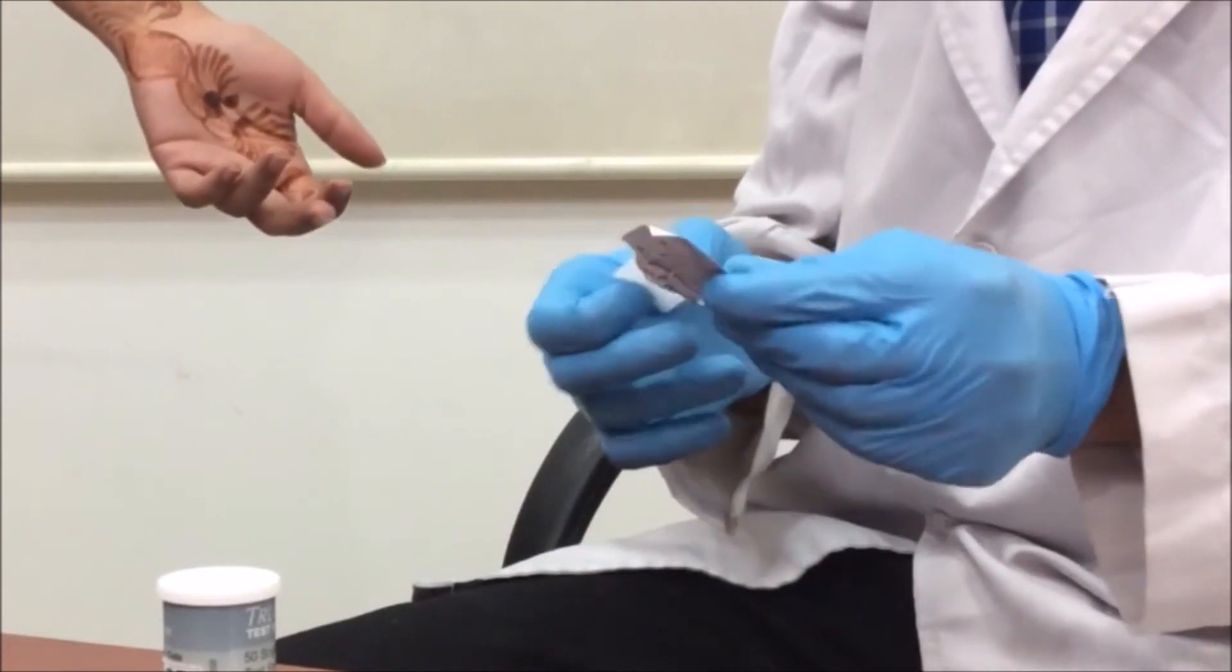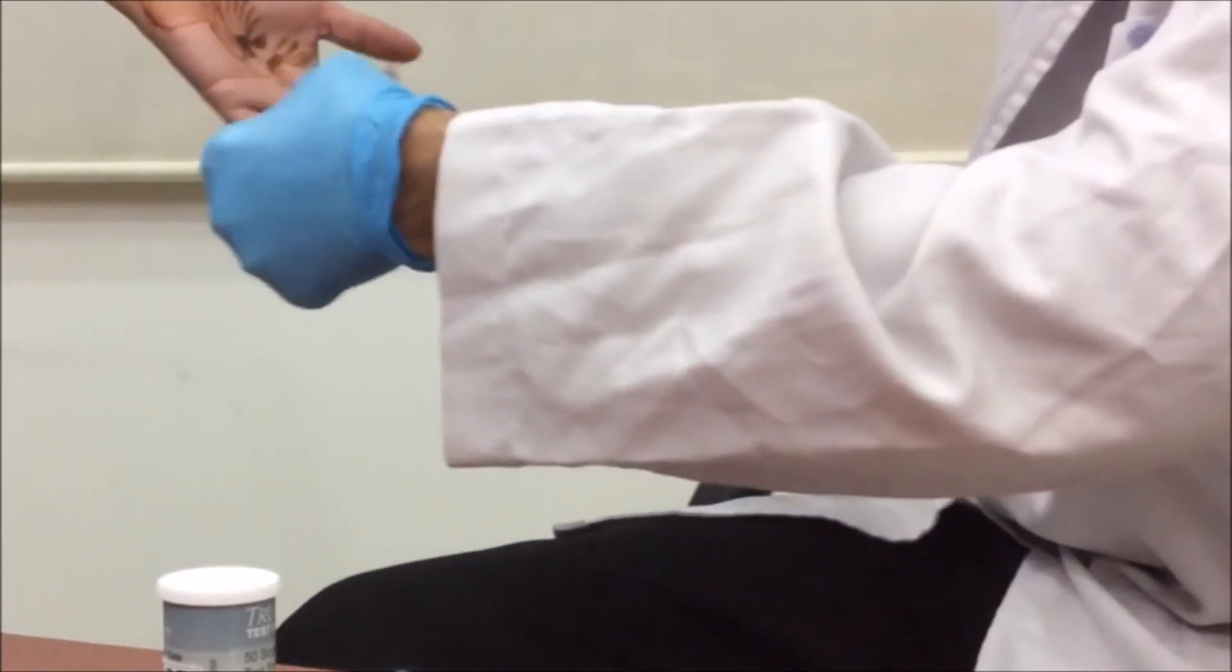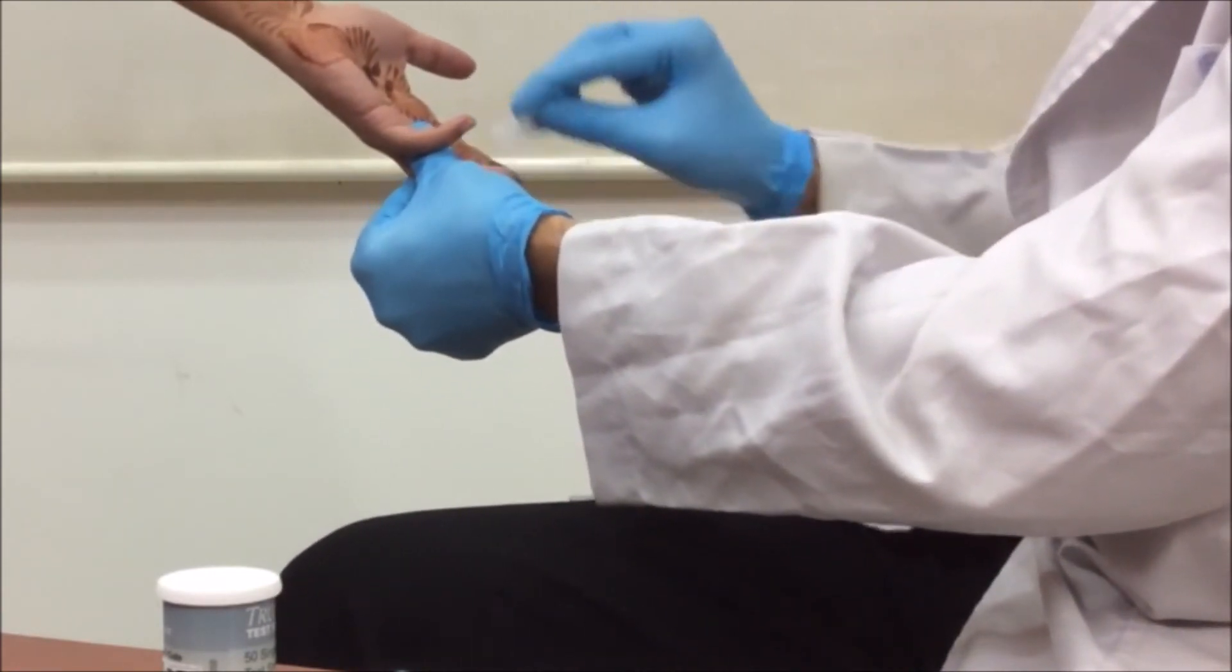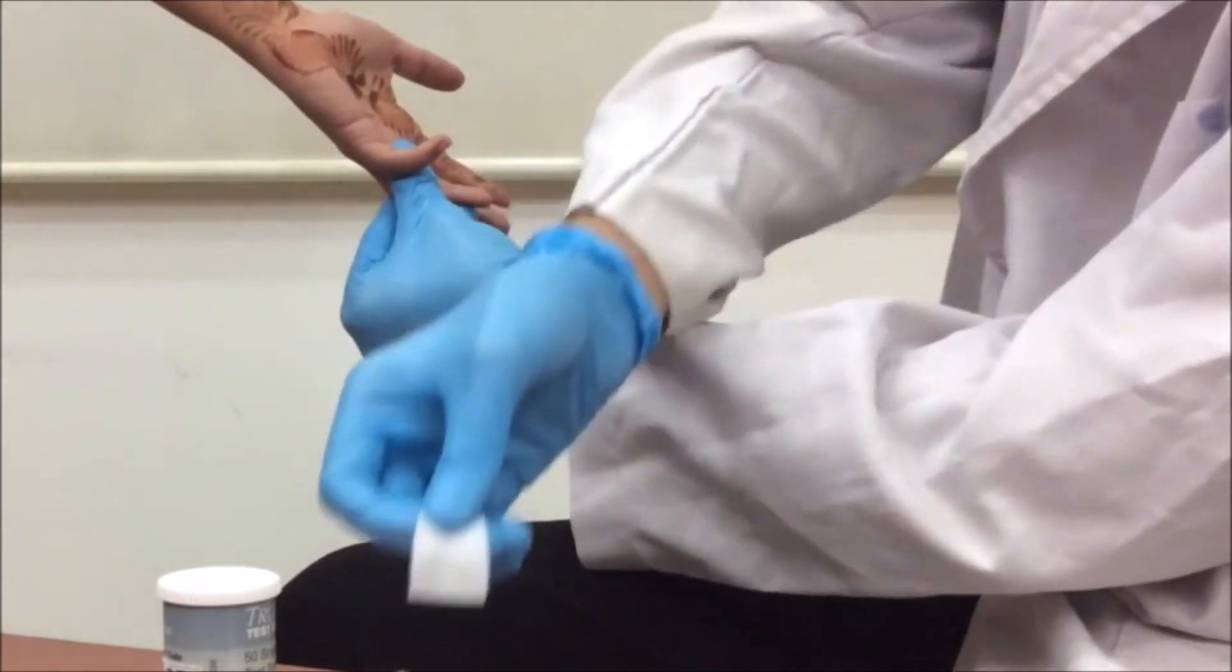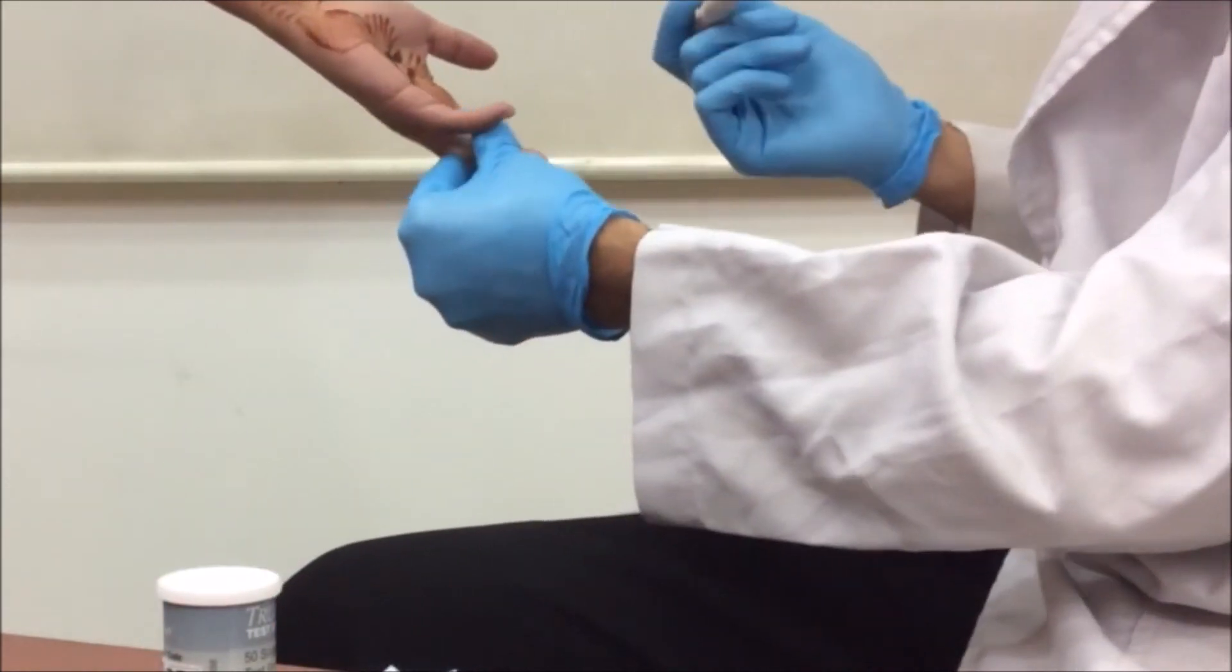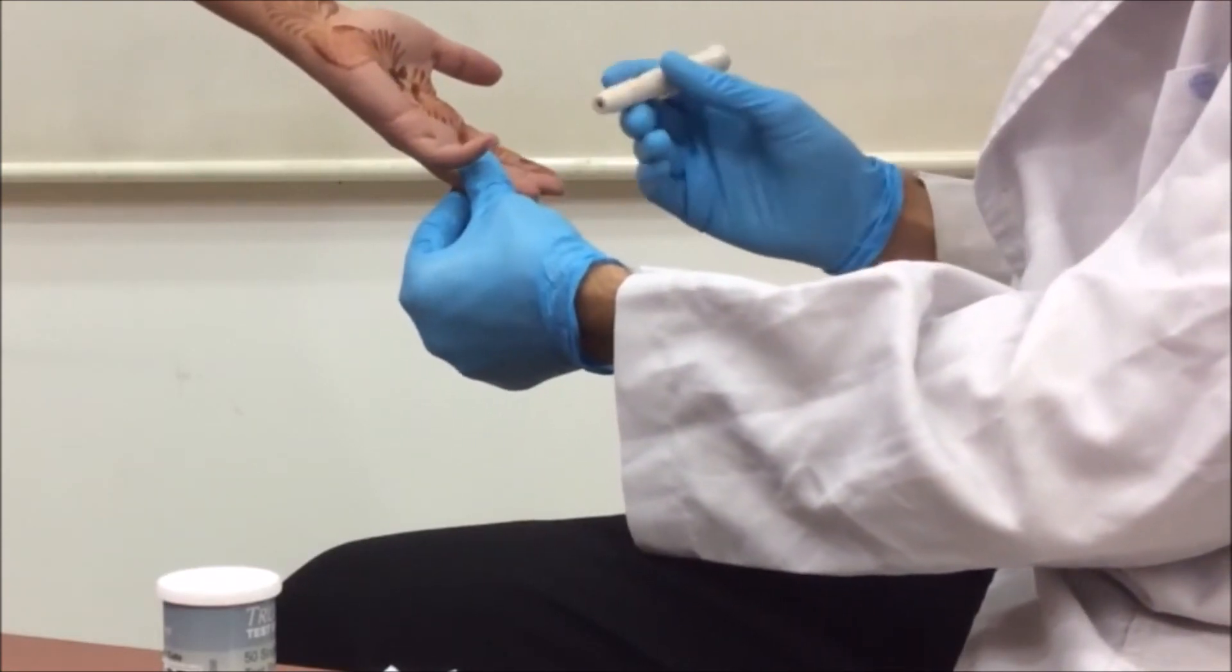Take the left hand of the patient and wipe it properly with the swab. Advise the patient to keep the hand warm and loose. Now keep the lancing device on the ring finger and prick it.